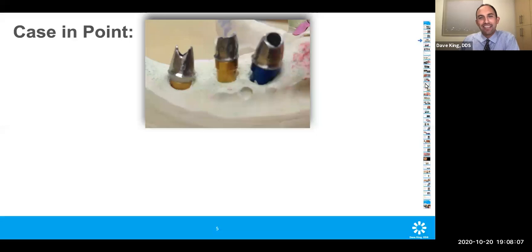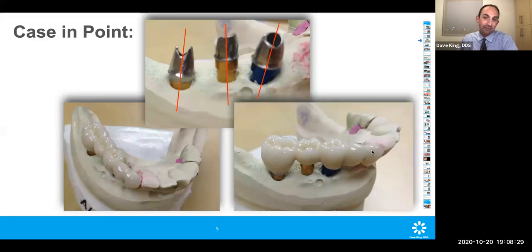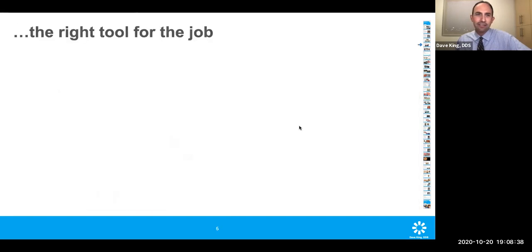Let's talk about a couple of cases. This is a case that I inherited from another general dentist at the office I started working at in Independence, Missouri in 2007. This is a picture of a model, and you can see these implants are not necessarily lined up. They're not ideal. So quite a challenge here to restore. Fortunately, we had some magicians in the dental lab that were able to make this 5-unit cantilever bridge look really, really, really nice. Turned out really well. Sorry, I have the gums peeled off and I couldn't find the picture with the soft tissue in place.